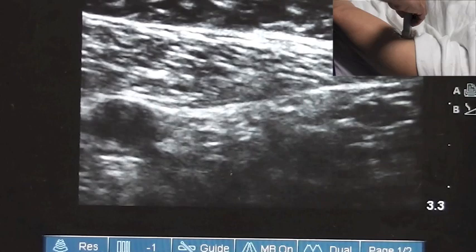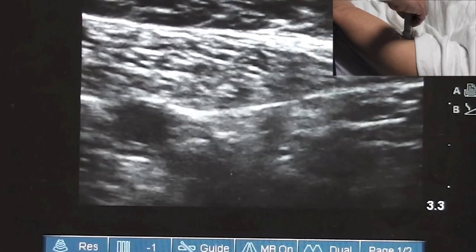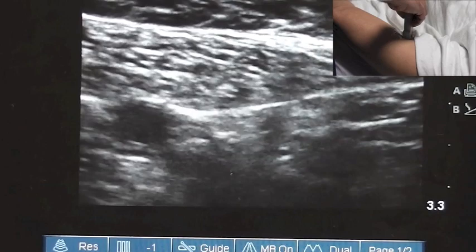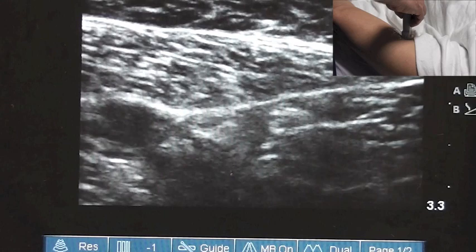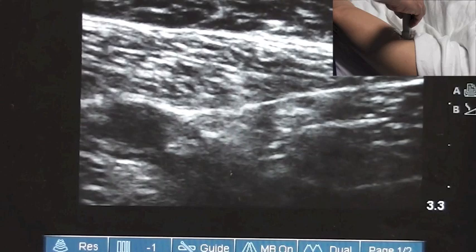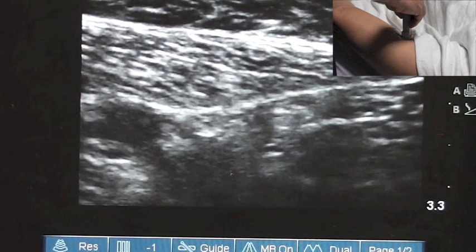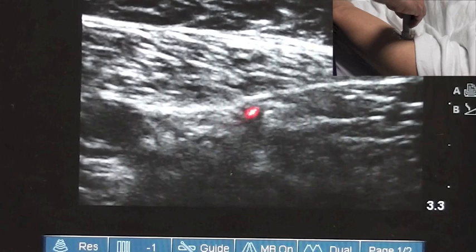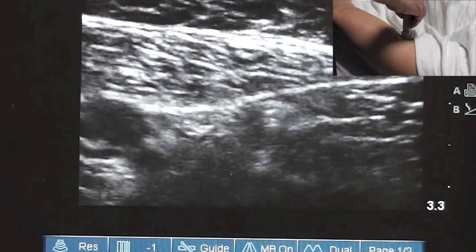Note that this is not a motor component nerve. So using a nerve stimulator, you may invoke a paresthesia in the patient in the proper dermatomal coverage into the medial aspect of the leg and ankle, but you're not going to see muscle twitch. Because it is such a small nerve, we do not need to use a lot of local anesthetic — no more than 10 cc's. The things to be concerned about in this block are that you are near vessels, so it's obviously important to aspirate before injecting and ensure you're not intravascular. Once you've confirmed that and see your needle position, I would ensure that the local anesthetic is invested around the nerve, underneath this fascial plane. Having done that, your block is now complete.